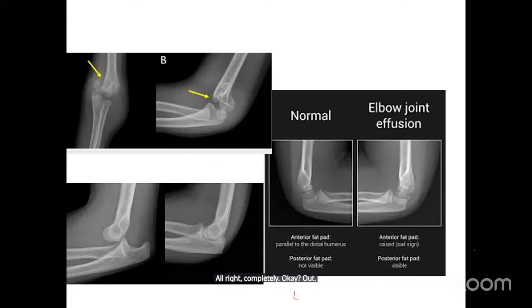Yes, sir. Now, how about this one? Dislocation. Can we see it now? Anterior dislocation of the humerus. We're not calling this subluxation now. We call it dislocation. Are we together? Yes, sir. This is the ankle joint, elbow joint, sorry. Yes, sir. How about this?